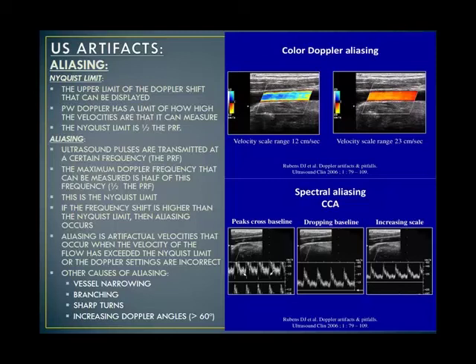Anything that looks like this, this is what we want to always see. Nice even color throughout.